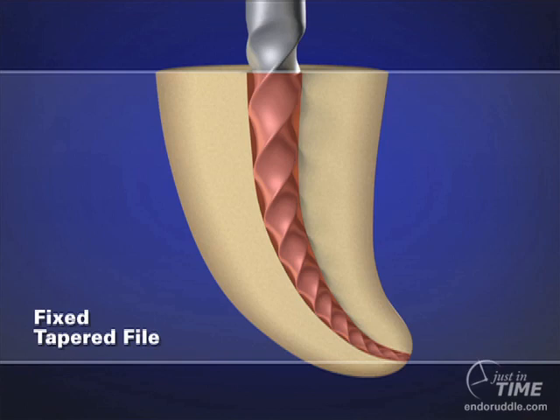So various manufacturers have used different machining concepts to mitigate taper lock, and you can find these in the various systems. But all instruments except for ProTaper and Wave 1 have fixed tapers. The problem then with fixed tapers is the screw effect, taper lock, and it usually takes quite a few instruments to impart the desired shape.